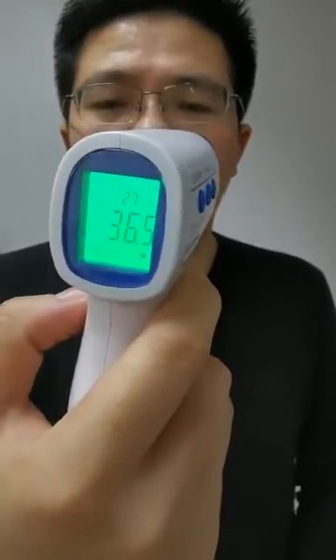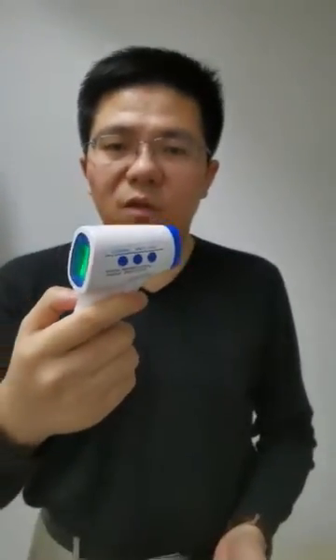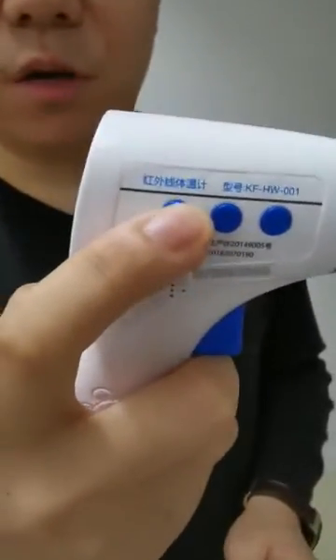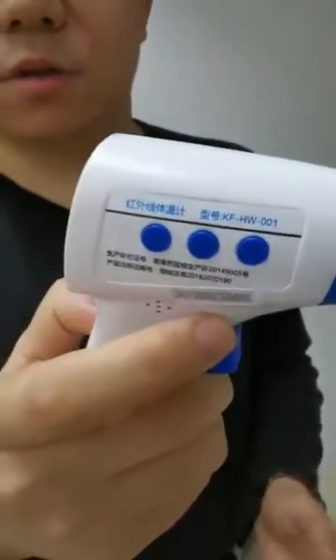That's it. If you want to shut it down, you just leave it, or you can press the button here — the set button — and press it for two seconds. Sometimes it will shut down.